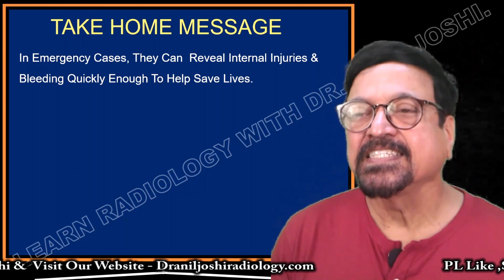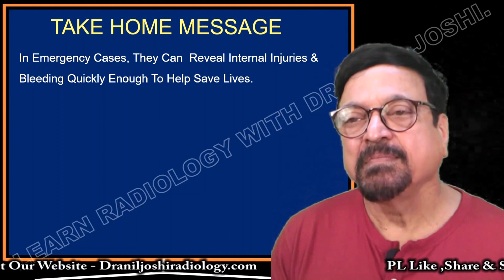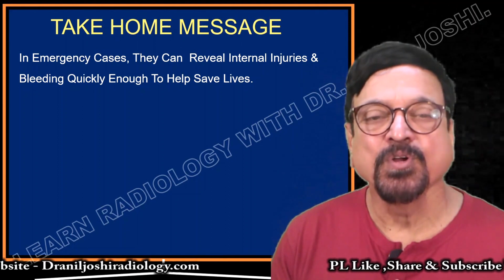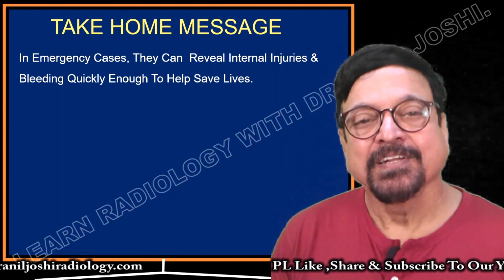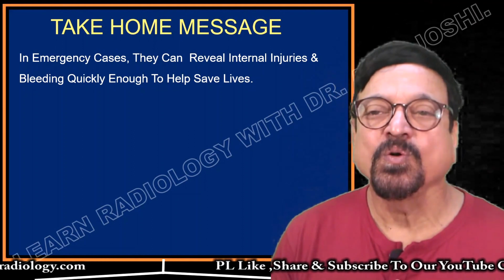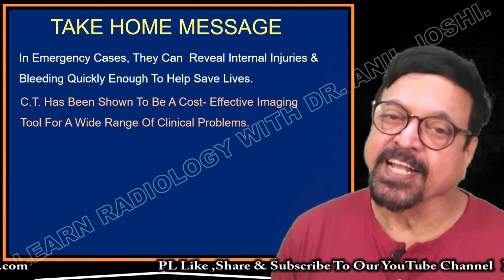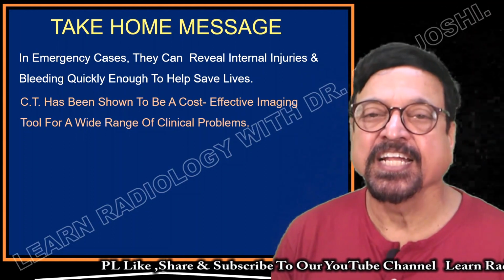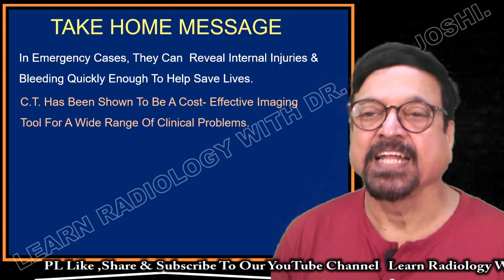In emergency cases, it can reveal internal injuries and internal bleeding, and it is very quick. You can directly take the patient from the emergency room or the casualty to the CT scanning room, and often the treatment of many things is given there itself. So it saves time, it is quick, and most of the time there are very few contraindications, not like MRI where you have to have the patient very steady. Here, if the patient is a little bit irritable, we can still manage.